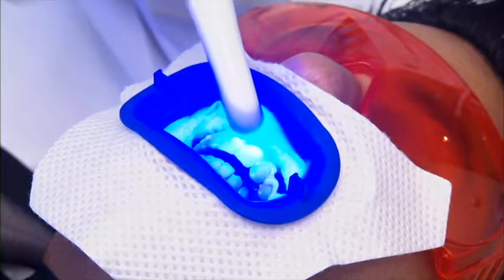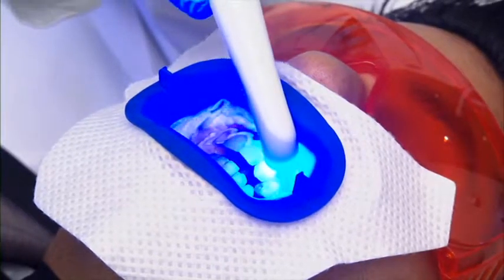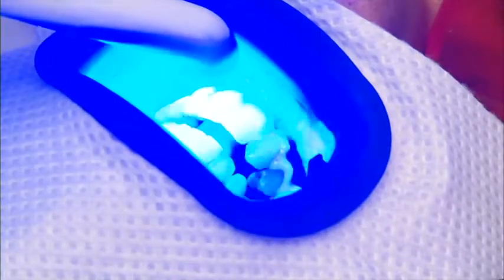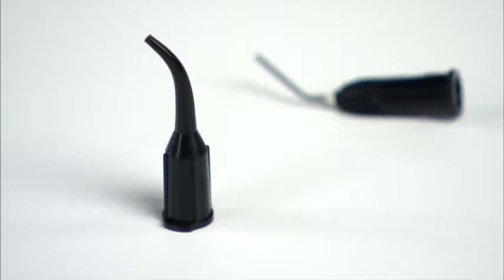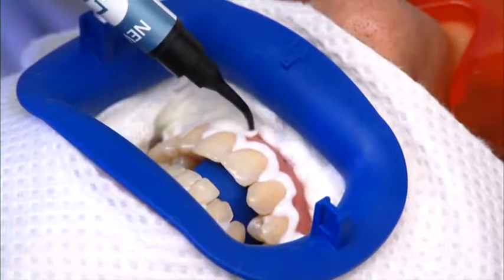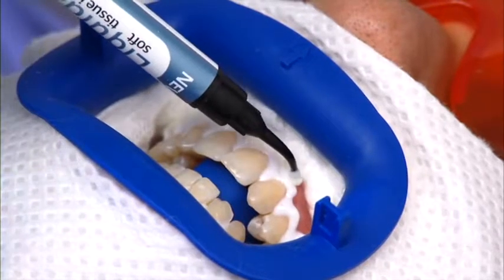Cure the application of Liquidam on the gingival margin using a curing light like a flashlight. Liquidam is a resin blend that can become warm upon curing, so use a sweeping motion, moving the light back and forth across the arch for about 10 seconds. Now change to the plastic tip and fill the space between the cotton roll and the line of Liquidam you just created at the margin and cure. Be sure to cover all interproximal areas, leaving no soft tissue exposed.